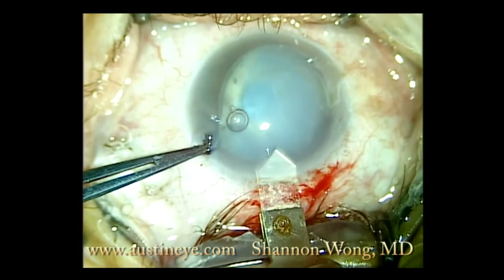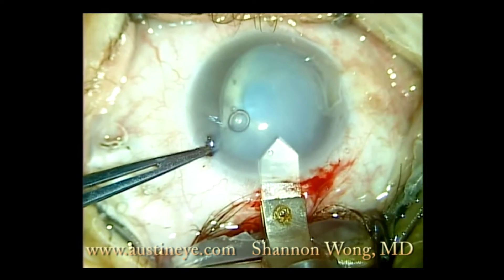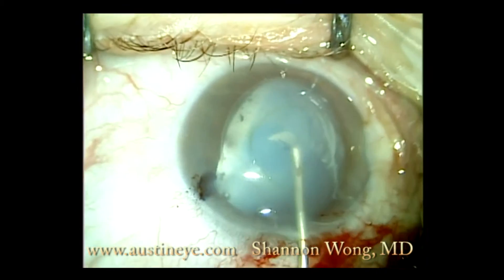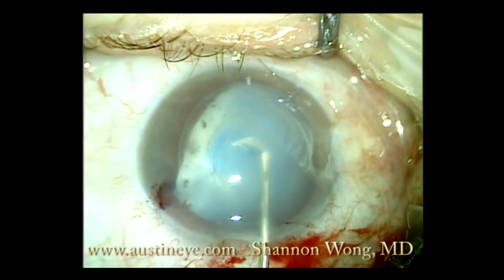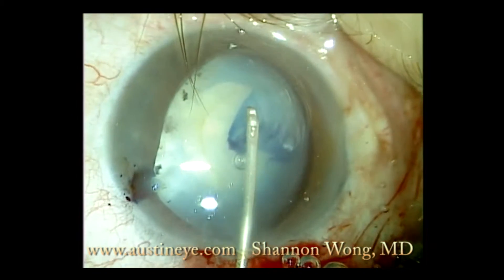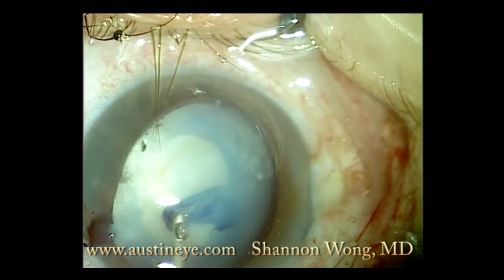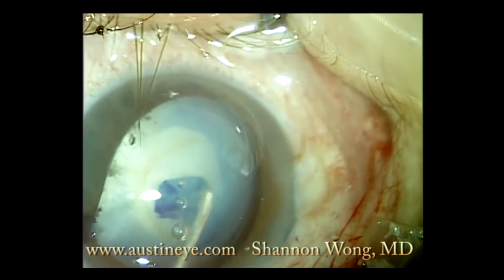The pupil dilated irregularly, and going into the eye we knew we would stain the capsule with Vision Blue, which is what we did. We very gently entered the anterior chamber after filling it with viscoelastic, and as you can see the iris wanted to prolapse even through the paracentesis port. Using a bent needle cystotome, we carefully fashioned a capsulotomy.